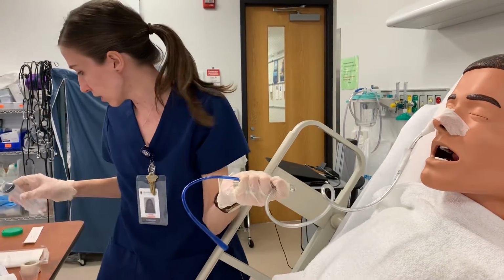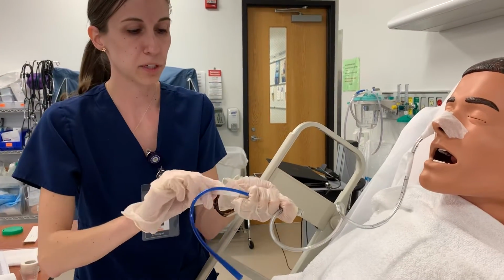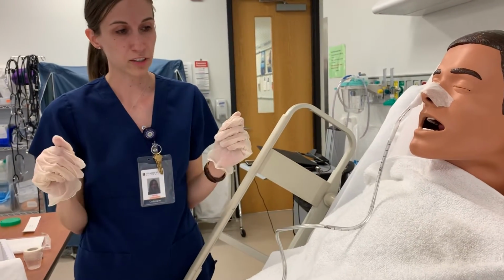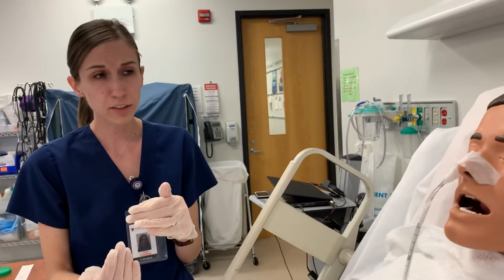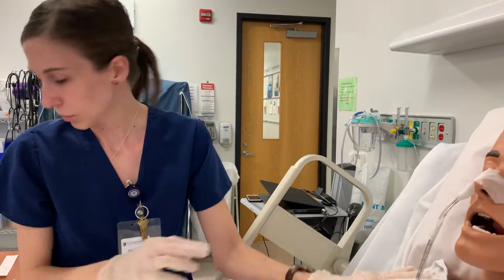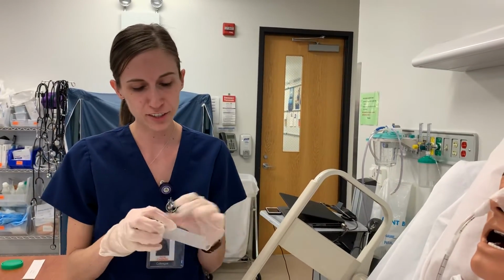Once I'm done with that, I can put this back down. I'm going to take my little connector piece and clamp that. And again, I've asked my patient is doing okay. They don't need anything at this moment. I will be going into the removal, but what I'm going to do is leave this in place because I will be doing the removal. But before I do that, let me make sure, so I don't forget, I do need to secure this to your gown.